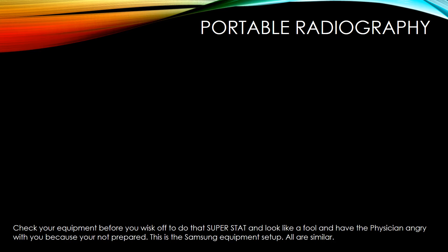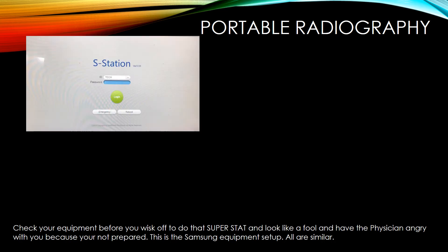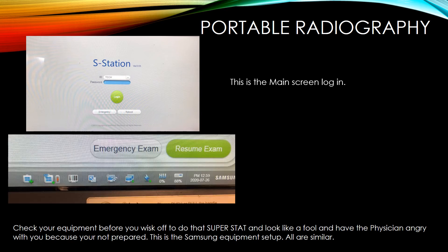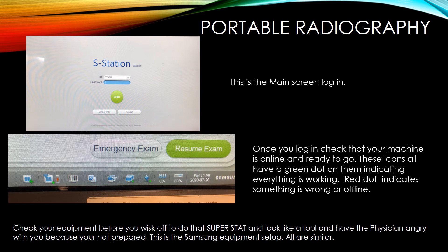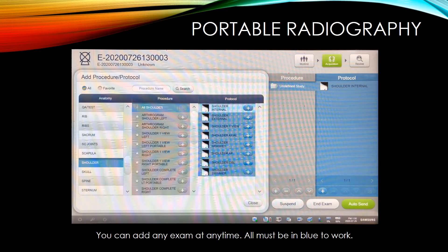Check your equipment before you rush away to do a stat exam. This is the Samsung equipment setup. This is the main screen page login. Once you log in, check that your machine is online and ready to go. Icons with a green dot indicate all is working; a red dot indicates something is wrong or offline — you may need to reset, reboot, or turn your IR cassette back on. You may add any exam at any time. For this machine, everything must be in blue to work. For example, to add a shoulder, you add shoulder in blue, then go to procedure, add all shoulder, then under protocol add each specific view you would like.